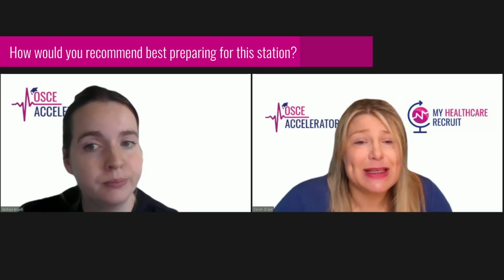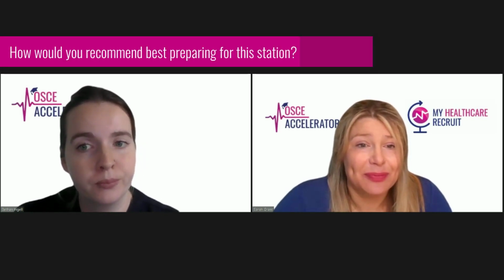Sure. The peak flow is single patient use, so that means that is to stay with that patient, not to be used for other patients afterwards. Got you. And how would you recommend best preparing for this station?